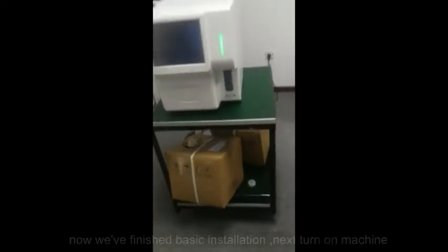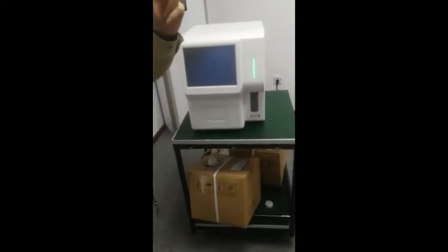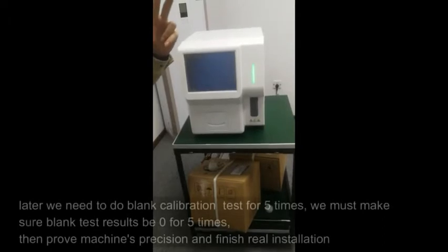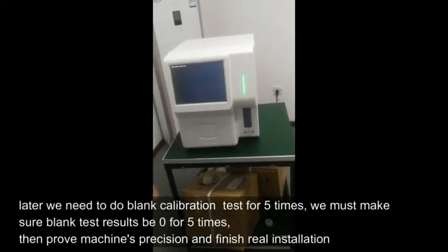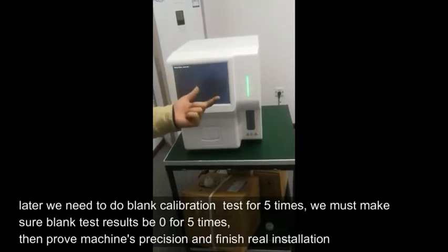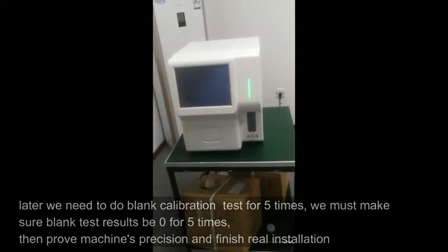Step 4: Turn on the machine. Now we've finished the basic installation — next, turn on the machine. We need to do a blank calibration test 5 times. We must make sure the blank test results are 0 for all 5 times, which proves the machine's precision and finishes the real installation.